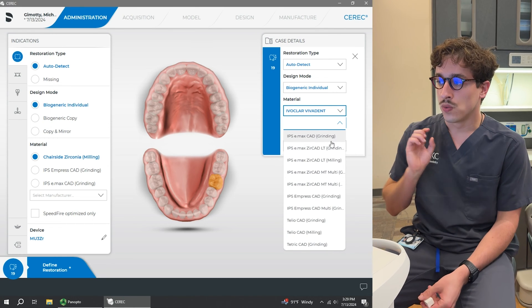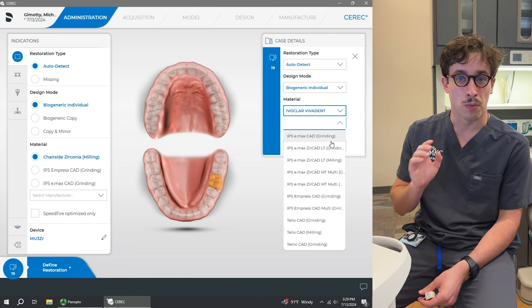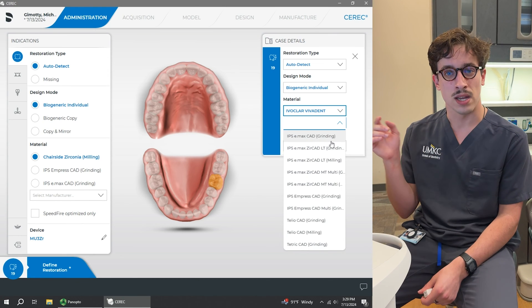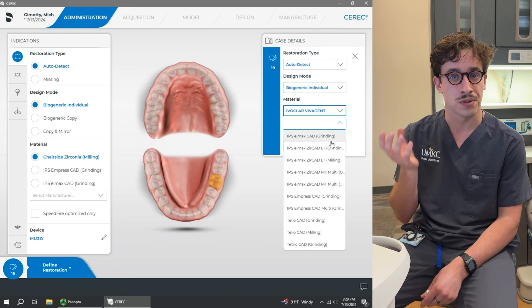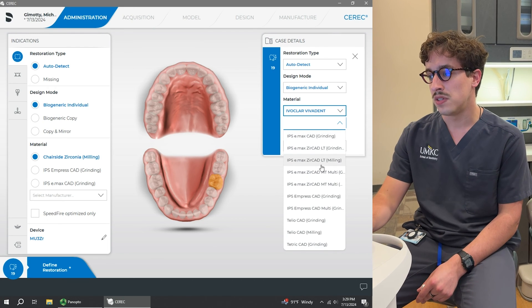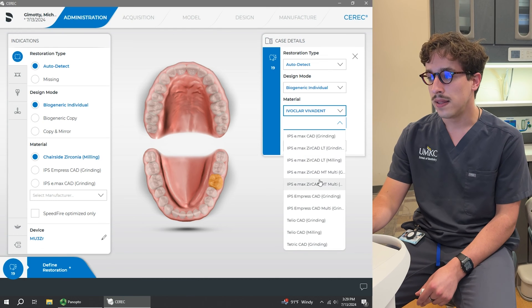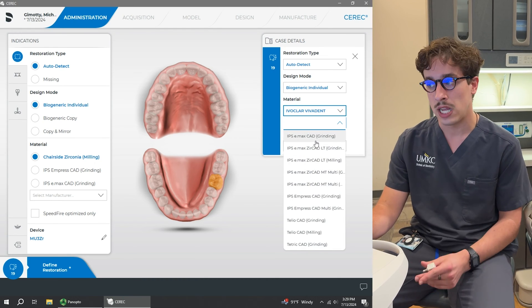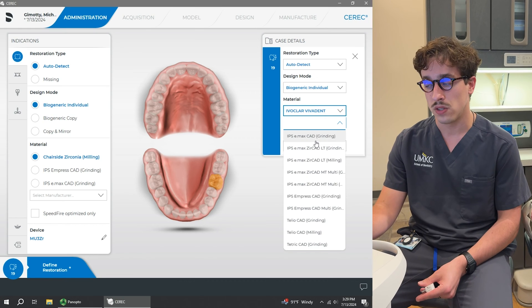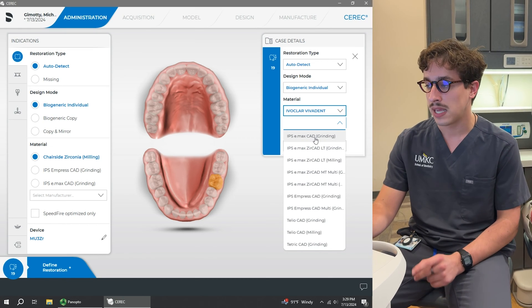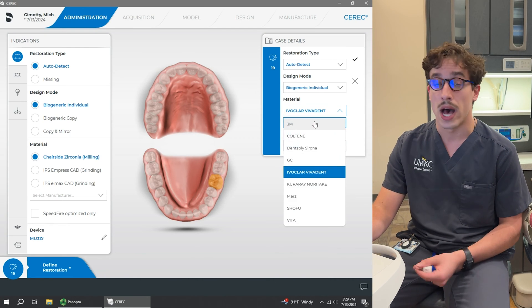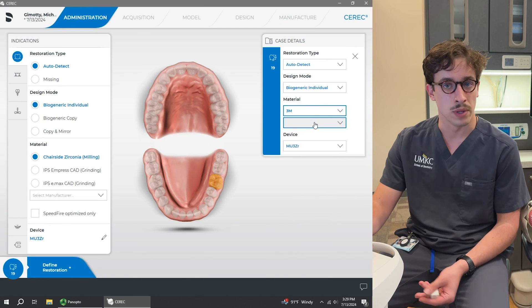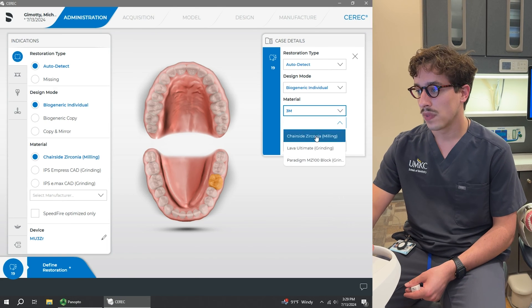Now, what's really confusing about this is that Emax is both a brand and a material. So there is Emax that is lithium disilicate and there's Emax that is also zirconia. So you need to make sure that if you see any of these that are Zircad, that's actually zirconia, even though it does say Emax. So if we're doing Emax, which we're doing a lot more of here at the school, make sure you select IPS Emax CAD at the top. Otherwise it will not work correctly because it's trying to mill in zirconia rather than lithium disilicate.